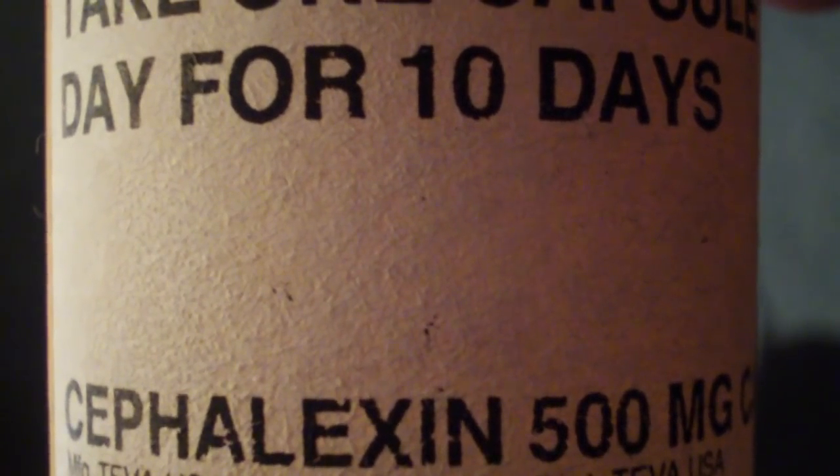George has been prescribed Cephalexin. First, we'll remove the bandage. This is the gauze, and it's a little stinky, so that's not a good sign.